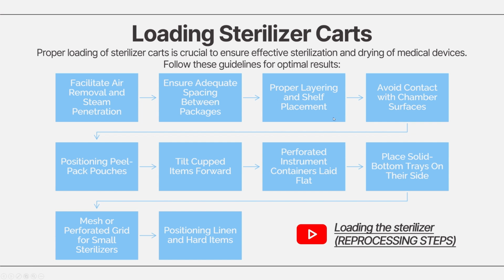And then there's also layering and shelf placement. Avoid stacking packages directly on top of one another. Each layer should be on its own shelf, with shelf spacing equal to the spacing between packages on the shelves below. Overloading reduces sterilant flow and drying efficiency.